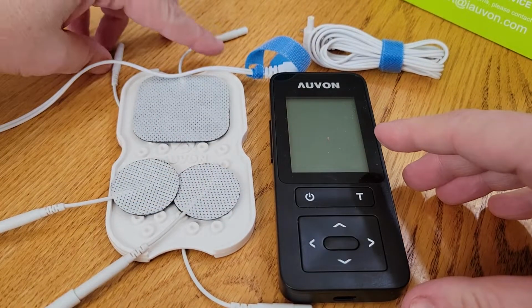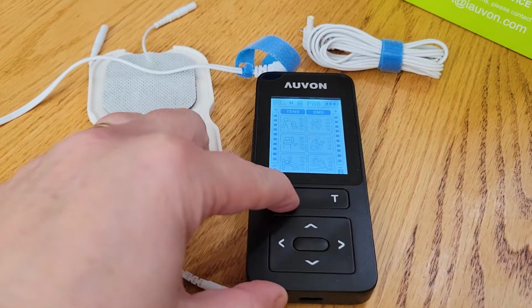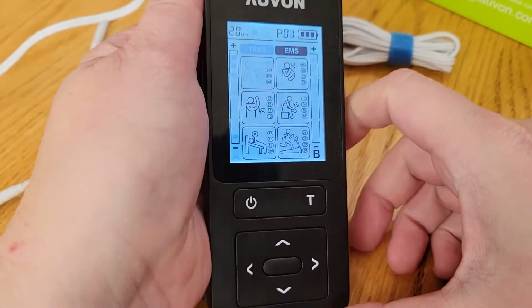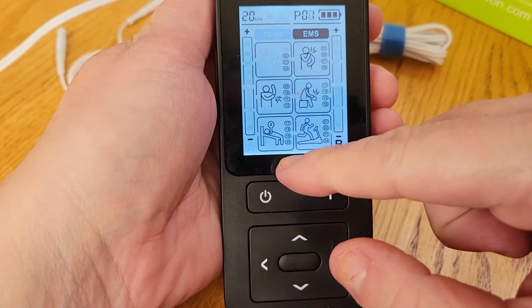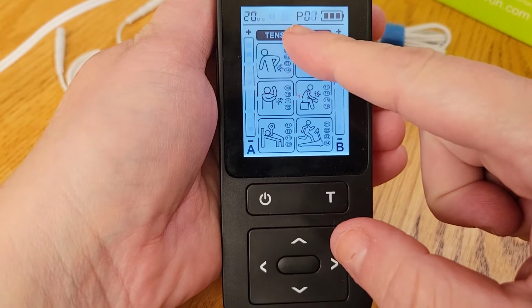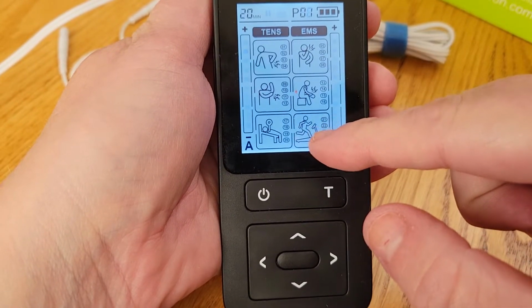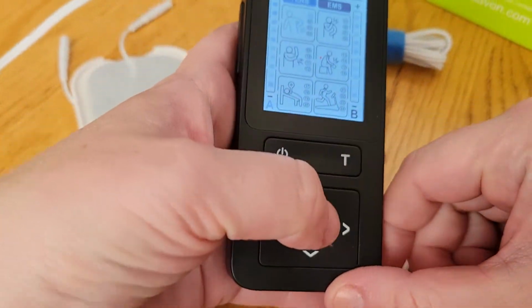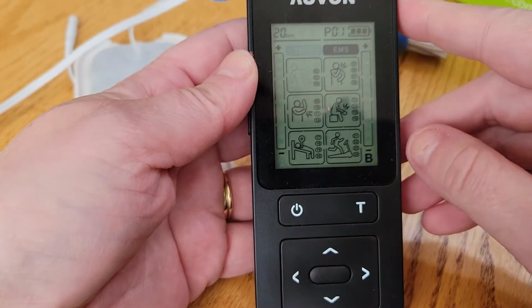And then at that time, you can go ahead and turn on your unit with the power button. And here we are. As you can see, A over here is blinking, and then it has all of these different little modes, 6 major modes, and then there's about 4 in each one. And we'll keep it on that one for now. Number 1, and like I said, the one that it's on right now is my favorite.